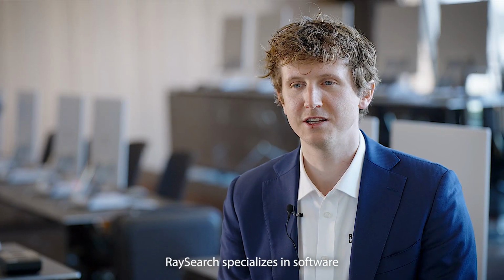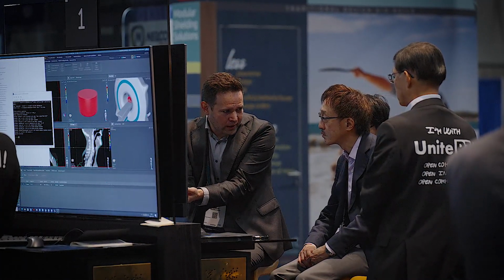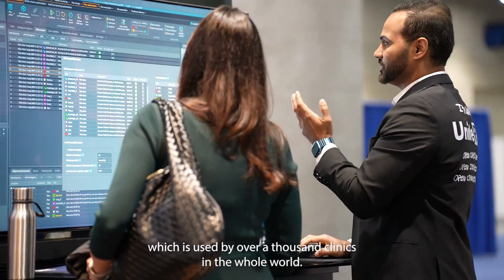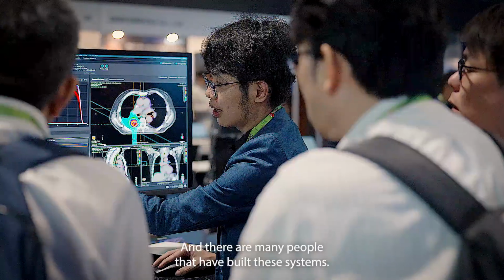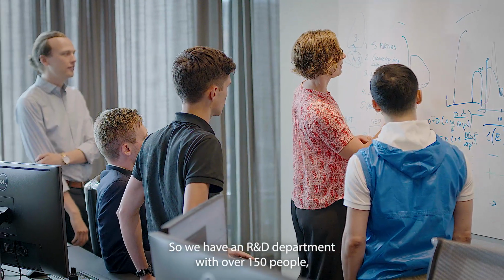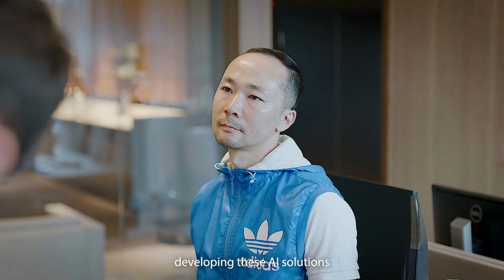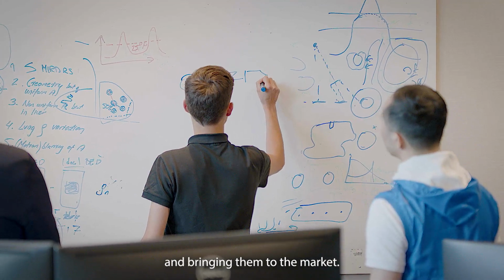RaySearch specializes in software, and we have a deep history in radiotherapy. So we have our TPS, or treatment planning system, RayStation, which is used by over 1,000 clinics in the whole world. And there are many people that have built these systems. So we have an R&D department with over 150 people, developers that have experience with developing these AI solutions and bringing them to the market.